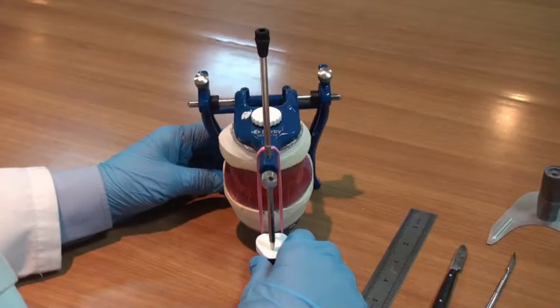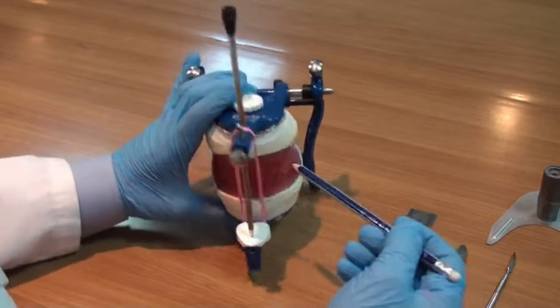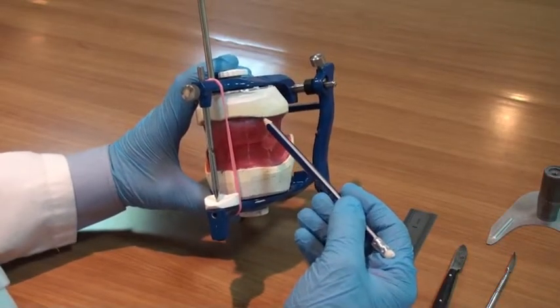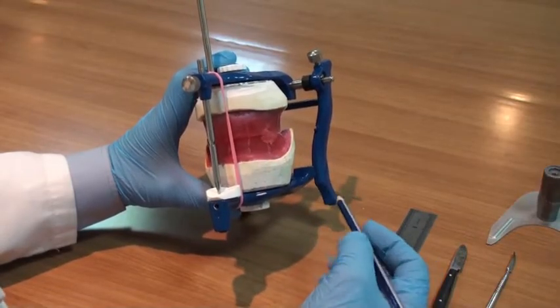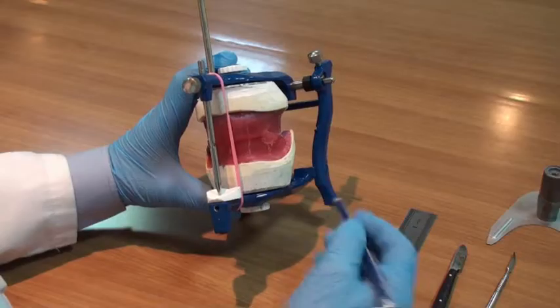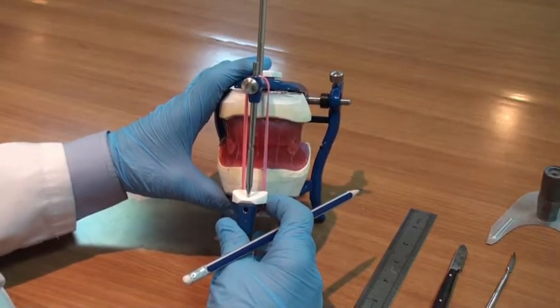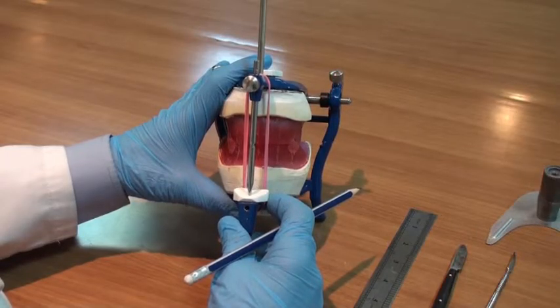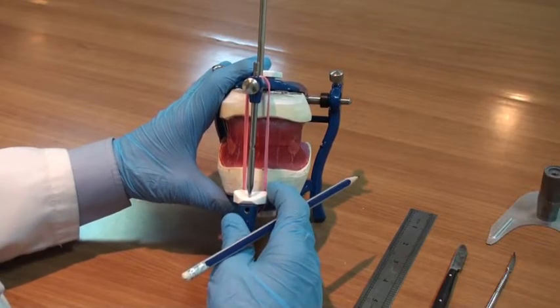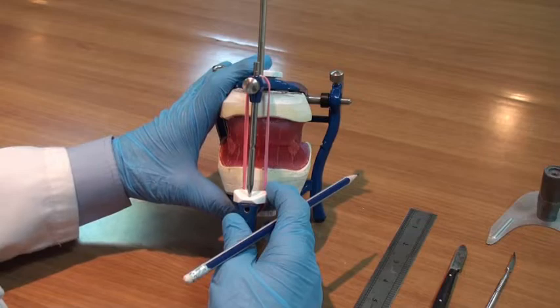Now, we have our occlusion wax rims and the record bases attached securely to the master casts mounted to the articulator. This articulator we are going to use, which is also used in most universities around the world, is an average value articulator, which will be discussed in detail while we are arranging the artificial teeth.